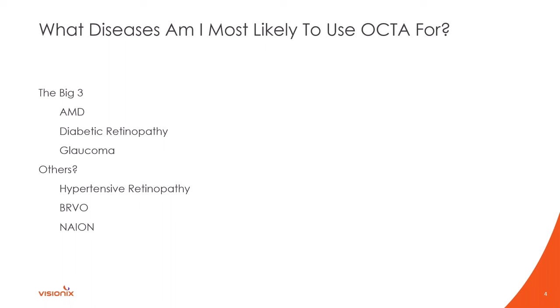I'll usually look at the summary scan first to quickly see where I need to spend more time, then blow it up to larger scans for more detail. Looking at the left eye superficial scan larger, you can see the vitreous face and we're concerned about tugging — we just don't want to see more traction develop. I don't think it's playing a role in the cystic space — I think that's more diabetes-driven. Looking at the deep scan, there's lots of dropout through here and up in this area. The macula has been relatively spared to date, but I have a feeling that may go south at some point. He's having injections, and I should be seeing him back in December.